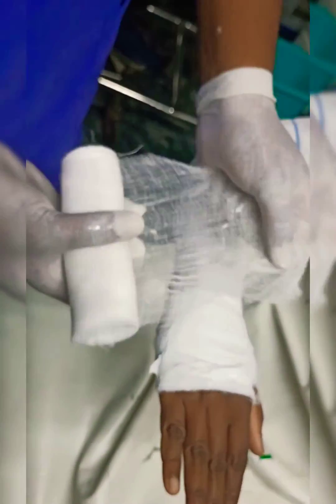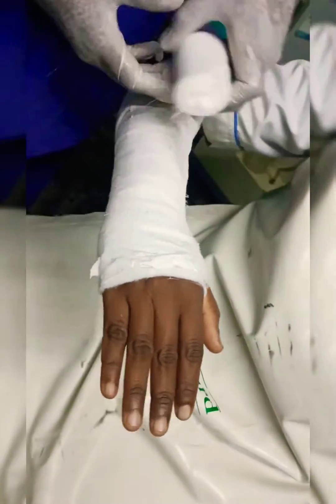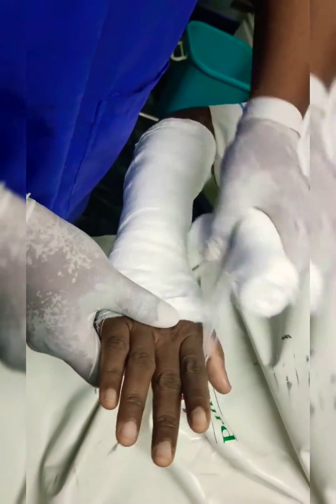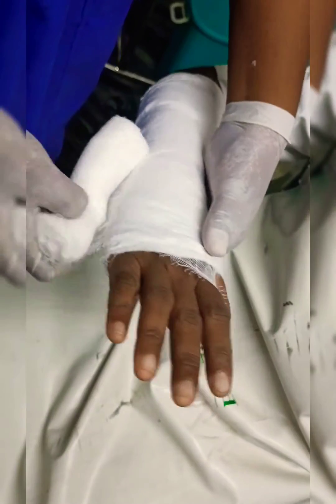Apply wet roller bandage over the forearm to fix the slab. This type of POP is commonly used for primary immobilization of forearm fractures.